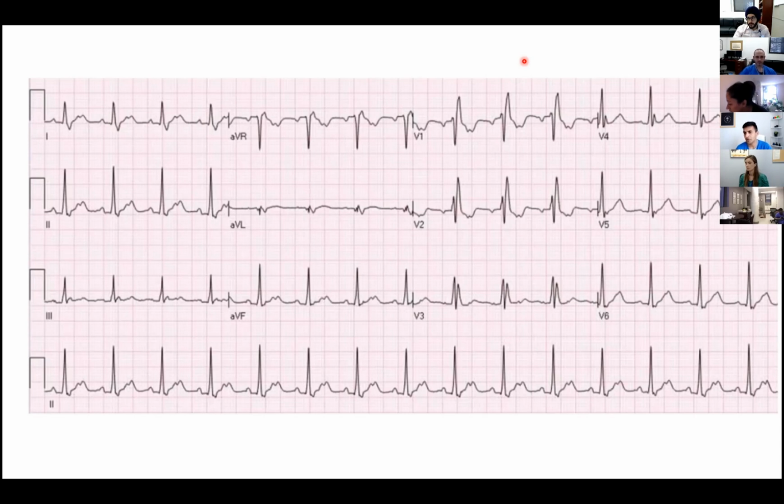Normally for atrial flutter, we look at leads 2, 3, aVF to look for a flutter wave, based on which we think about whether it's a typical or atypical atrial flutter. Yeah. So I see that in 2, 3, aVF the P waves are positive. I'm not really sure if there's a way to differentiate between that and focal atrial tachycardia.